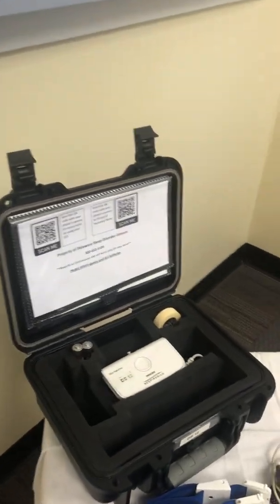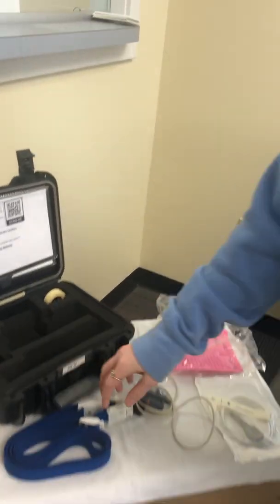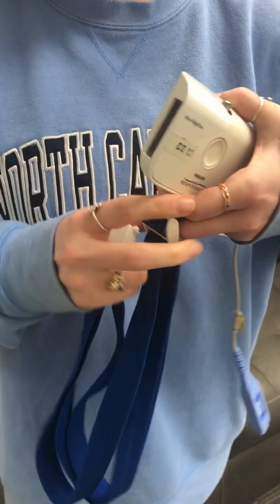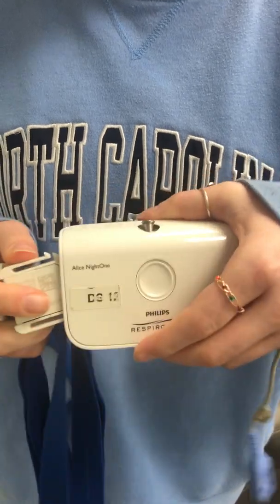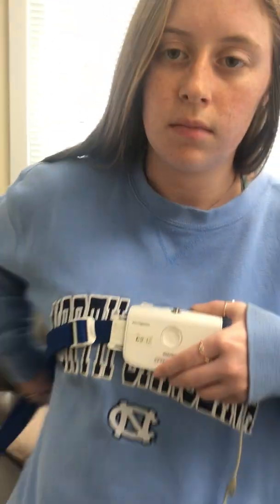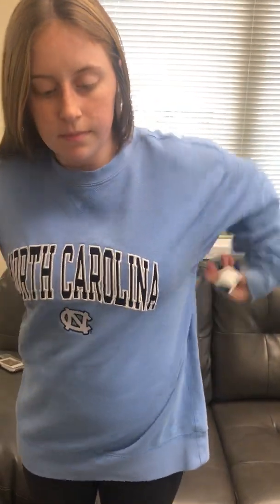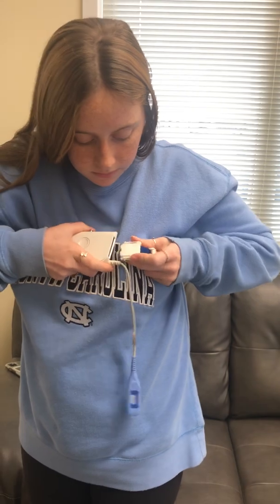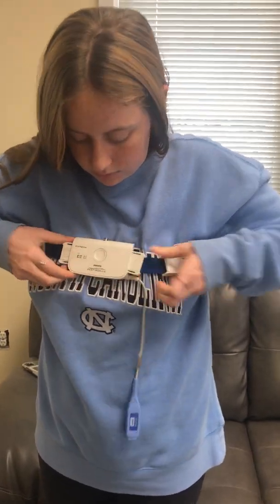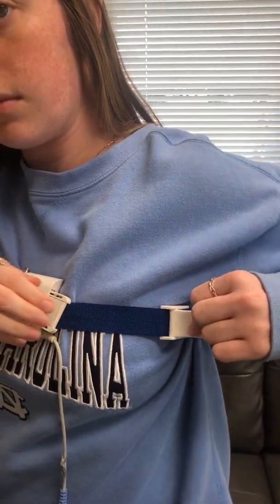Please take out the device, grab the belt and click firmly into one end of the device. Then wrap around the chest so the device can be snug. If you need to loosen the device, simply lift the latch and slide as needed.